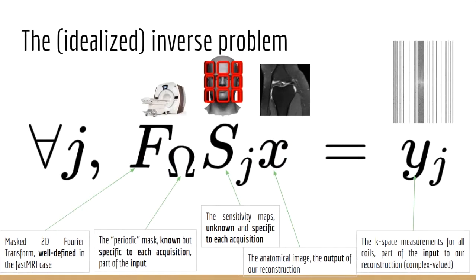The reason why we're going to take the undersampled Fourier transform is because we want to spend less time acquiring data, and each line of Fourier transform actually takes some time to acquire. So if we want to accelerate the acquisition, we have to take fewer Fourier lines.